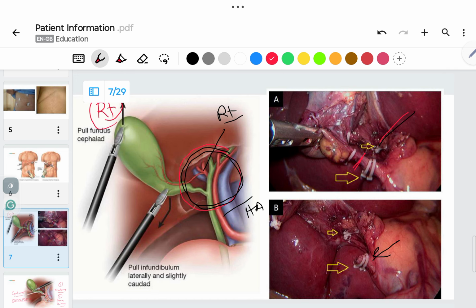Patients might be obese, they have metabolic syndrome such as diabetes. So the liver may not have good reserves within, and if we see intraoperatively the liver looks a bit unhealthy and it looks fatty, then I start to avoid doing a cholangiogram if I can, or if I have to do it, I dilute the contrast.